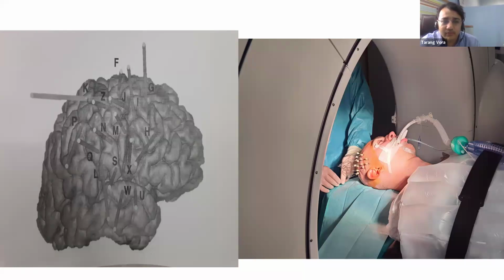We have a map of the brain where we plan out different areas, and then we make tiny holes on the skull under guidance. As you are seeing on the image on the right, the patient is under an O-arm. O-arm is an intraoperative radiological device which takes images, like a CT scan, but in an intraoperative phase. And during the surgery, we are able to merge the image of the preoperative MRI with the plan and the O-arm to see if the location of the electrodes that we have placed in the brain is accurate.